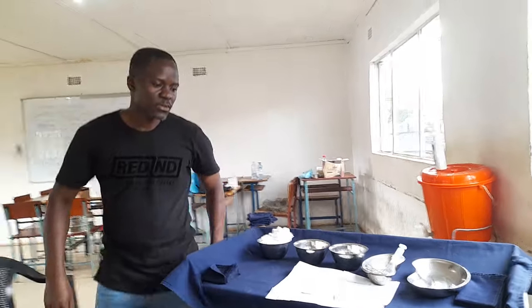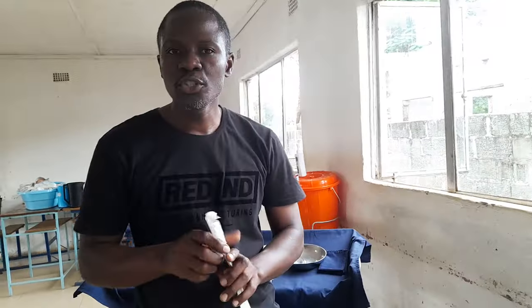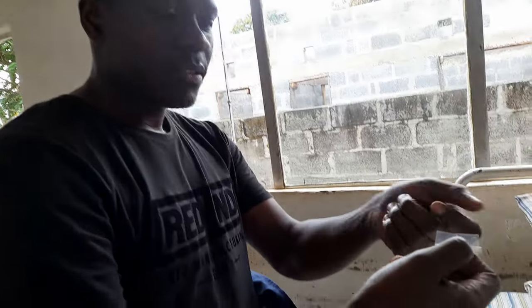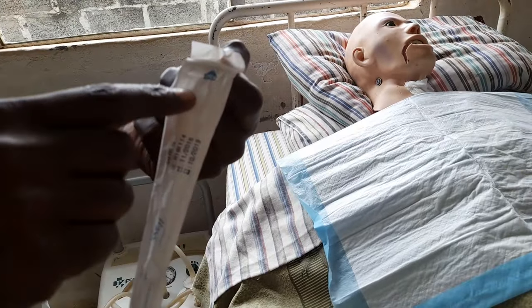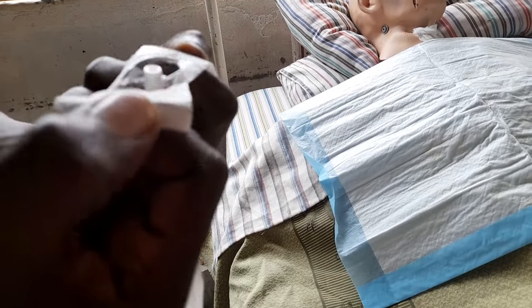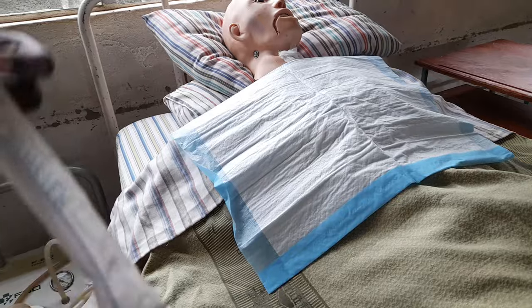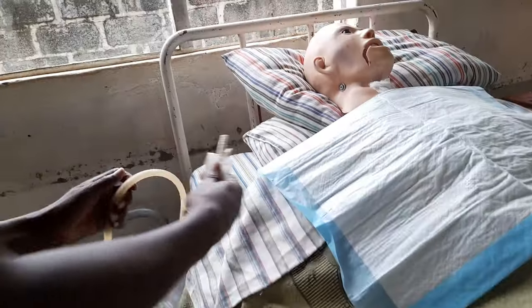Now connect the suction catheter to the suction tube — this is the trickiest part for students. Open the catheter packaging where it says 'open' and peel, exposing only the connector end. Do not fully expose the suctioning end. Then connect that end to the suction tube.